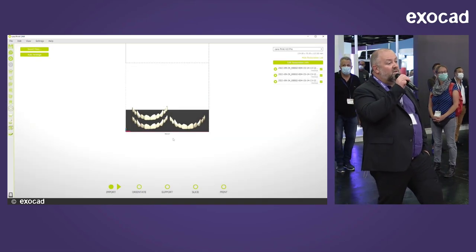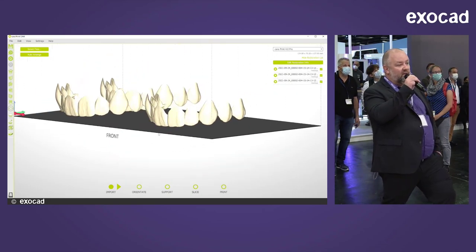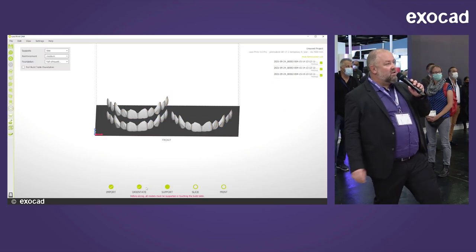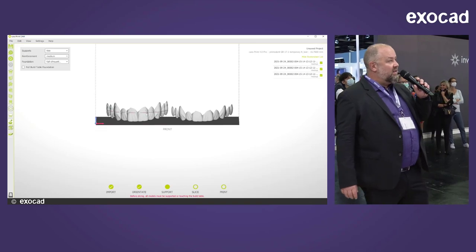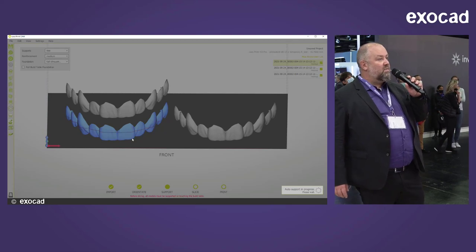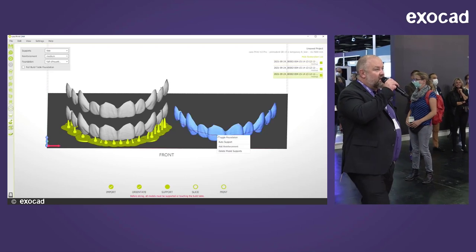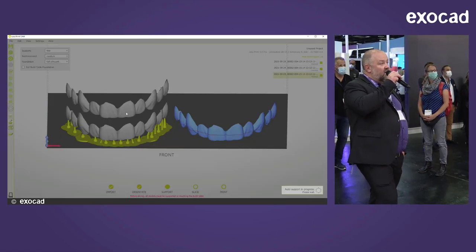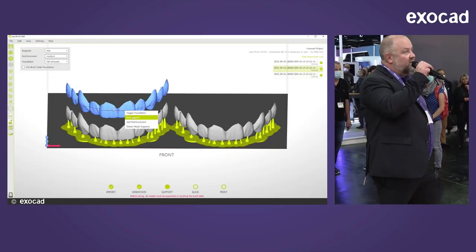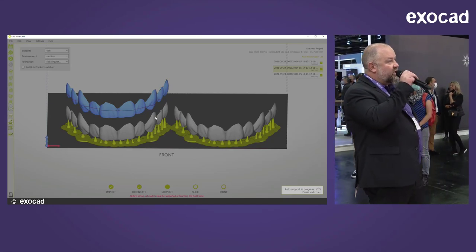I got my first introduction on Tuesday night while preparing the booth, and on Wednesday morning I did my first print. You can learn it in 10 minutes. The software makes an automatic proposal for orientation on the plate, and the support pins are also placed automatically. Sometimes this takes a while depending on the case, but here it goes quite fast. You can also influence that — choose larger support pins or change the number of support pins.